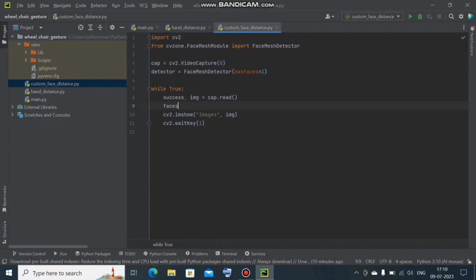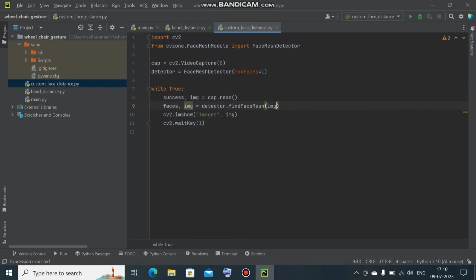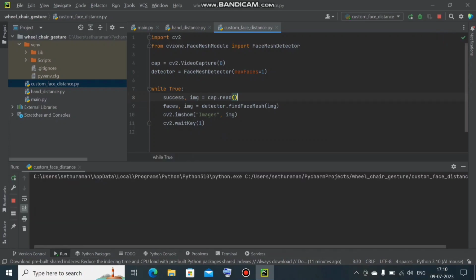Then faces and image: in the variable image, I'm going to ask it to find the face in the image. So image is equal to detector.findFaceMesh of image. Now let us see.